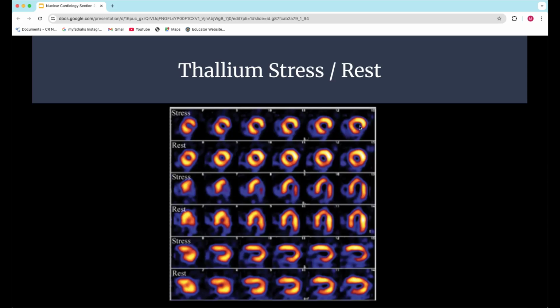And so now the question becomes, there's a couple of terms I want you to think about. Well, before that, let's just analyze where this is at. So we've got an area that's not getting blood flow. We look down at the rest and it is getting blood flow, right? So that tells us that there is what we call a defect here. When you hear the word defect, what they mean is an area that did not perfuse or doesn't have blood flow, okay?